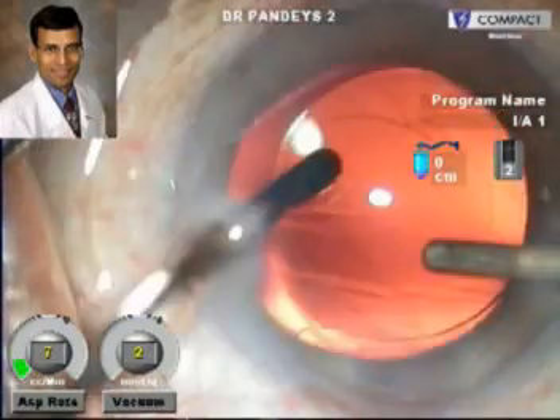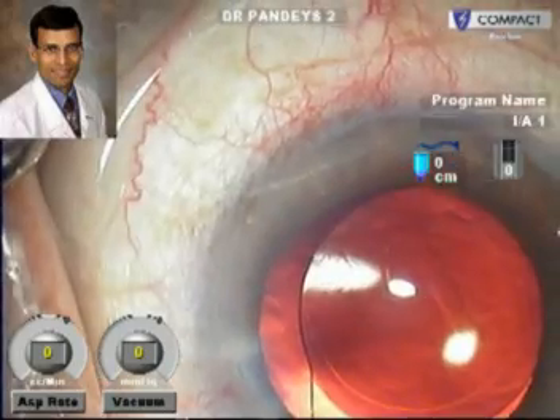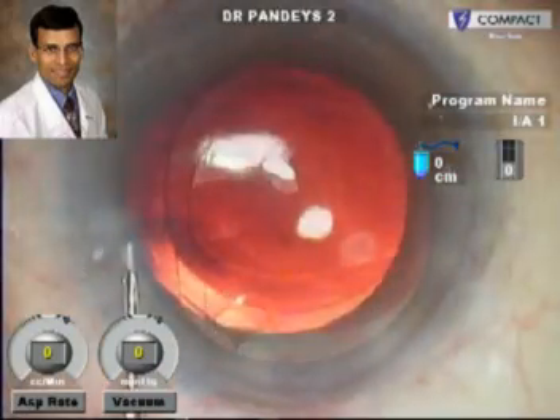After the IOL implantation, the viscoelastic is removed from the capsular bag, especially from under the IOL, and the result, as you can see, is extremely satisfying.